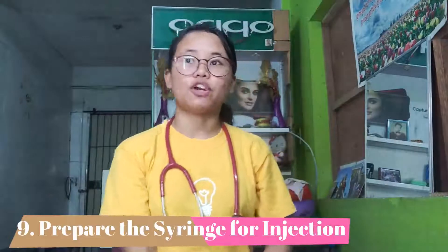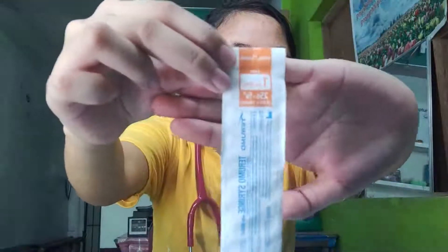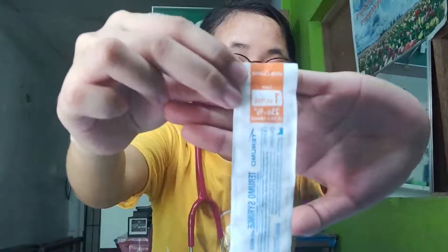Then prepare the syringe for injection. This syringe is the one we will use — 1cc or 1ml with a 25 gauge needle.